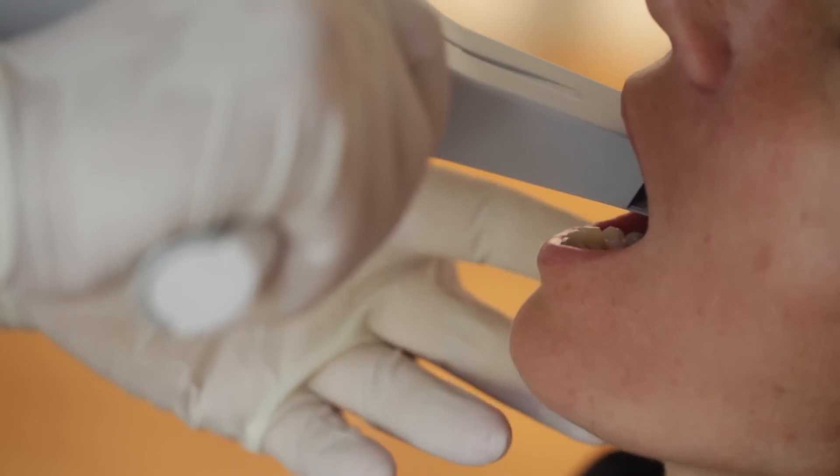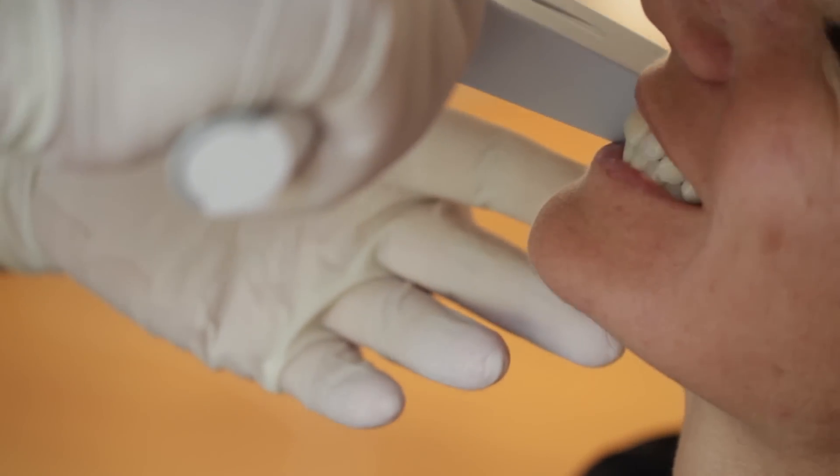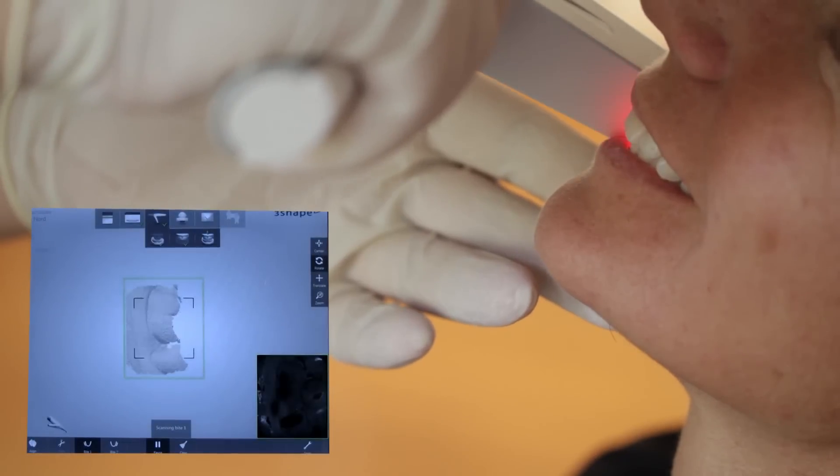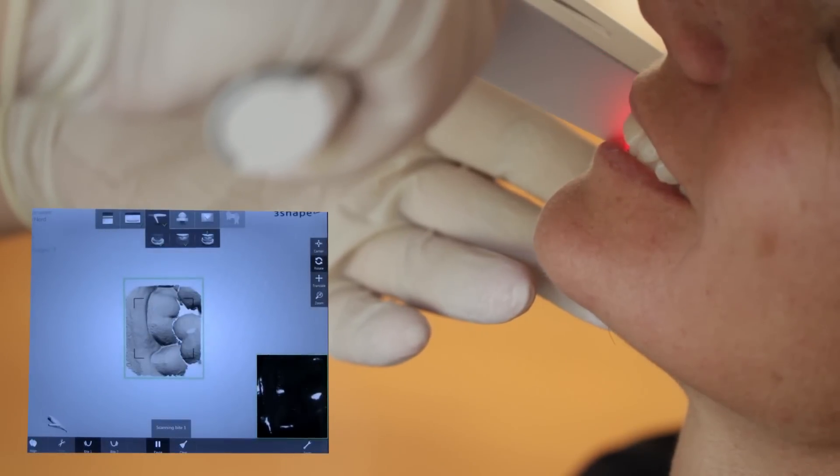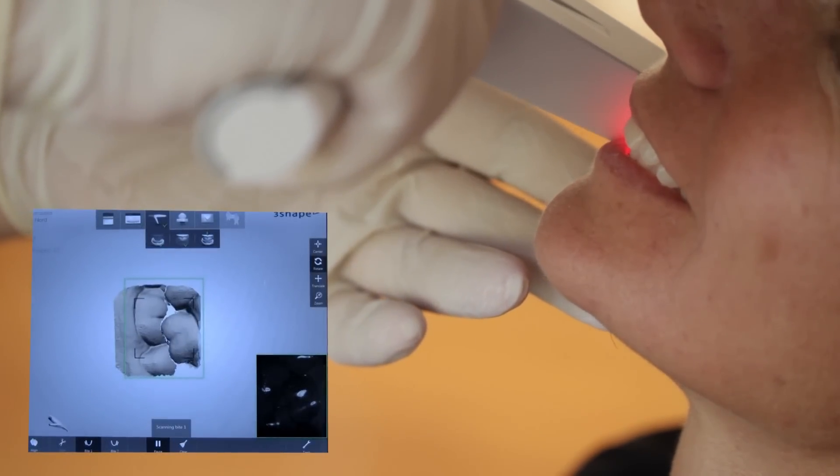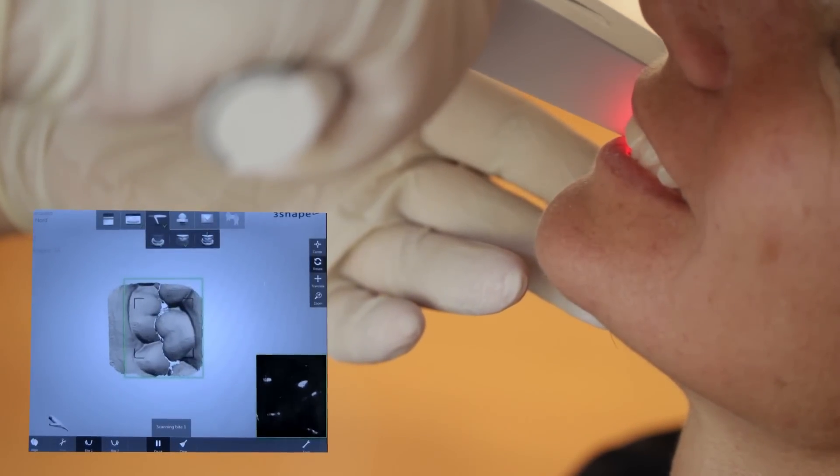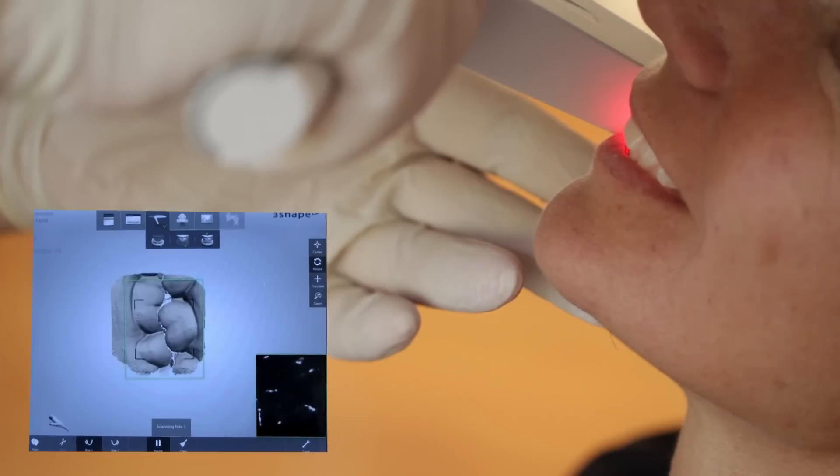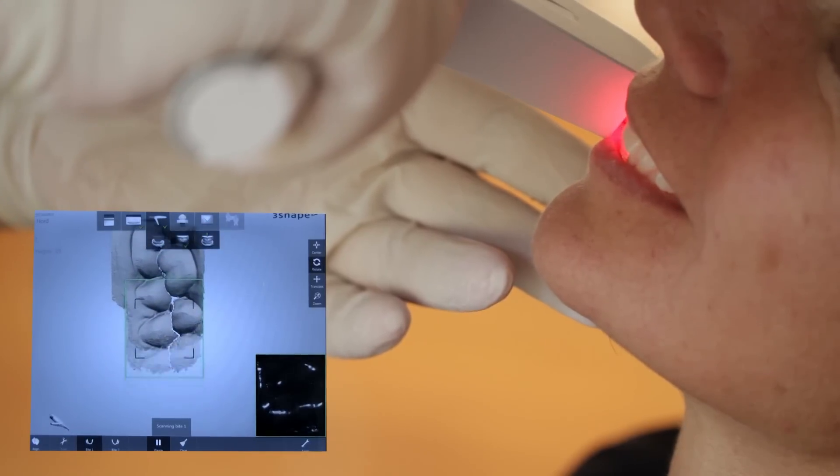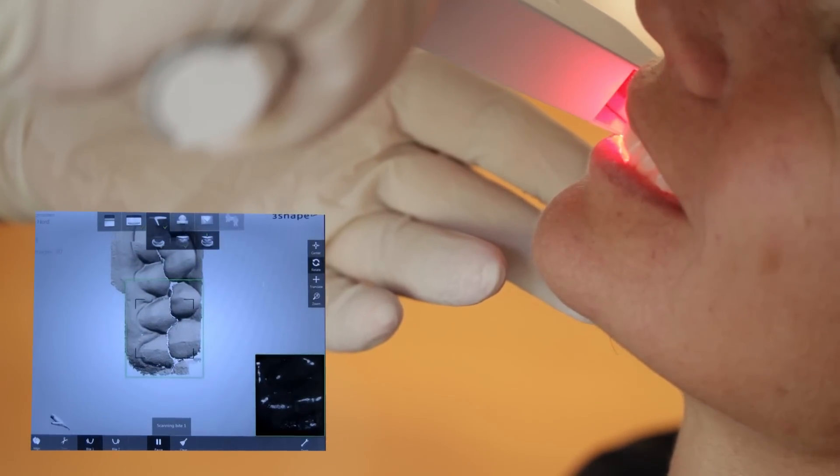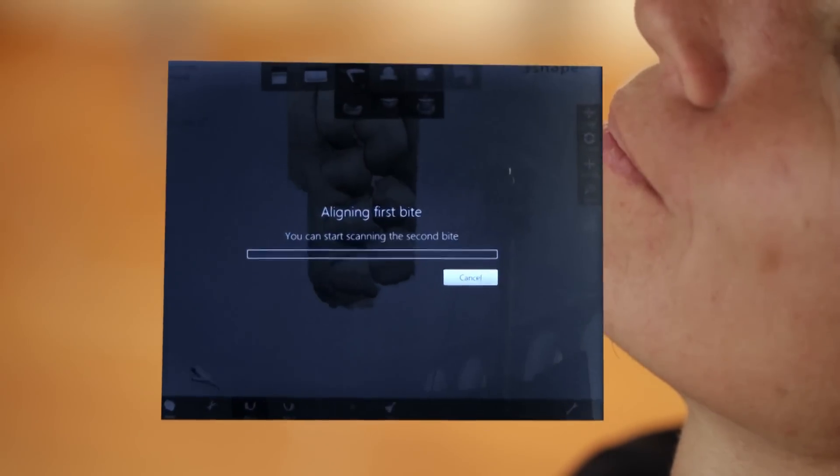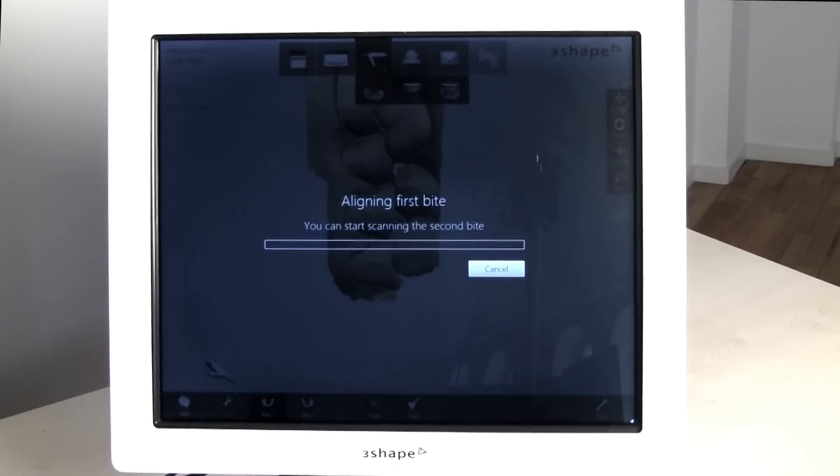Insert the scanner on the buccal side and ask the patient to bite. Then slowly retract the scanner in a straight motion. Align the scanner so that the occlusal plane is in the middle of the scan. After the bite is captured, the system automatically computes alignment of the jaws.